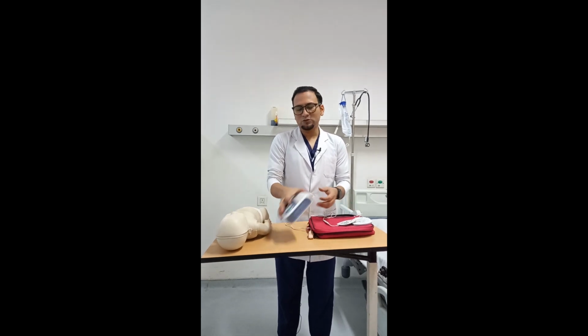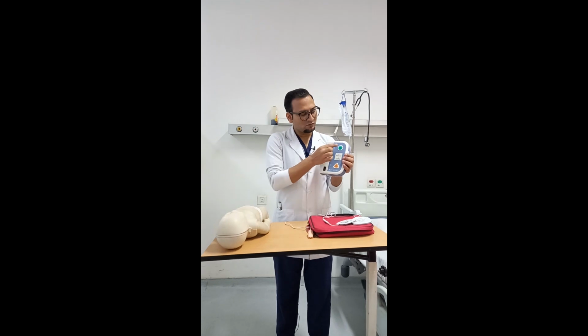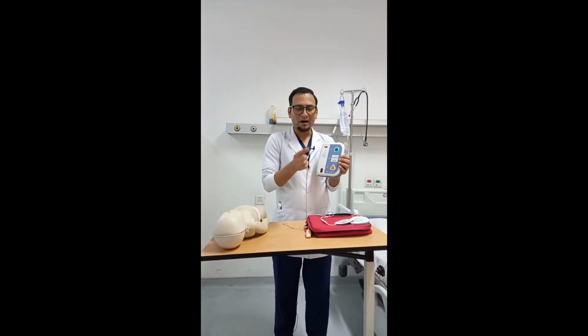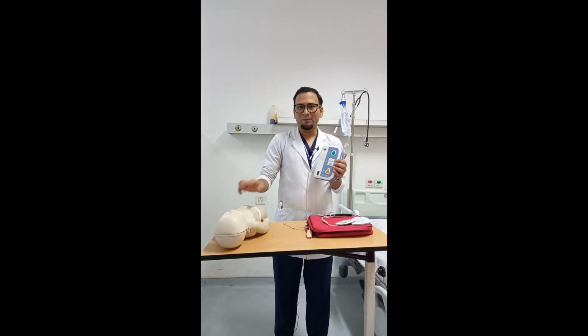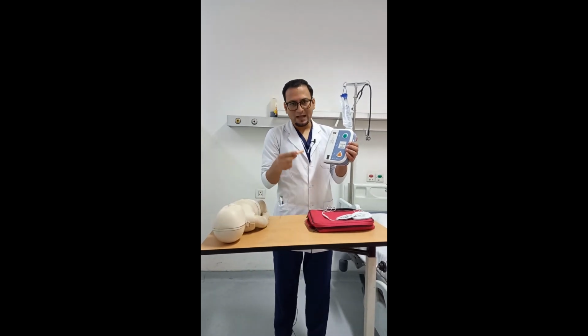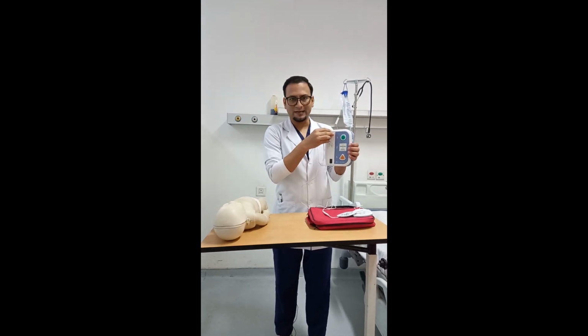Now I will teach you how to operate this AED device. First we have to press the green button. Then the AED will give you a command: apply the pads on the patient's bare chest. Then we apply the pads on the patient's chest area. After application of the pads, there is a plug-in, so we have to plug in the connector.